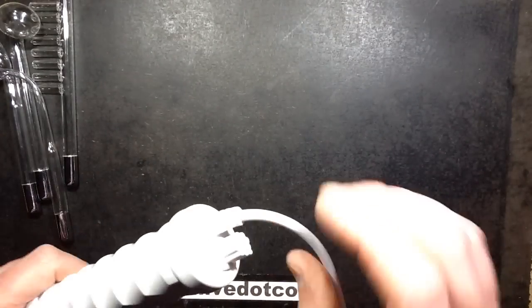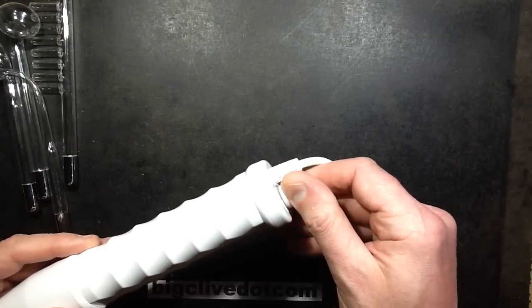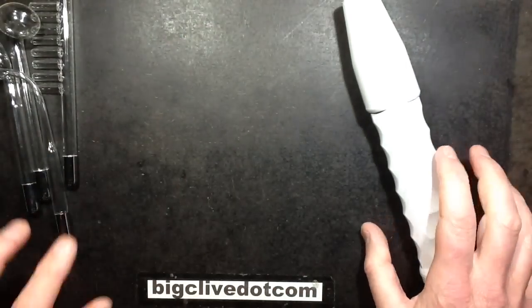Now, it's obviously electronic because this is a potentiometer at the bottom. It's not the usual mechanical coupling. I could actually show you right now. Just hold on. I'm just going to go and get an actual mechanical violet ray unit.